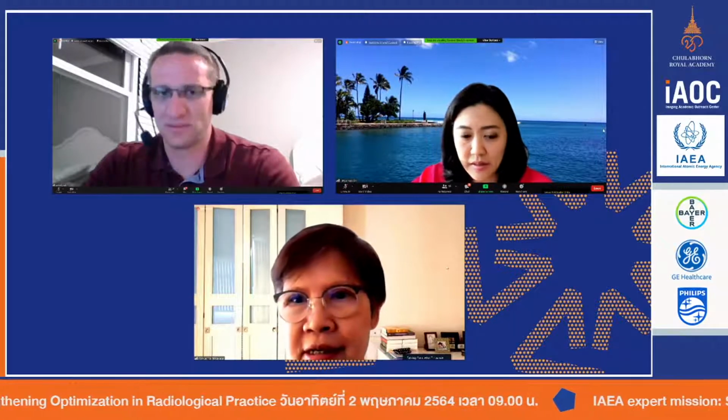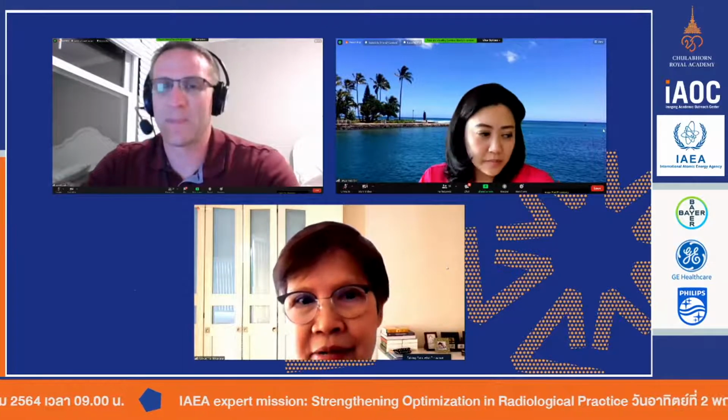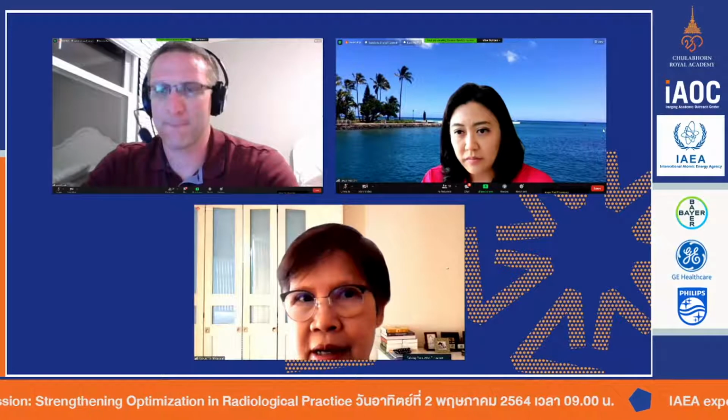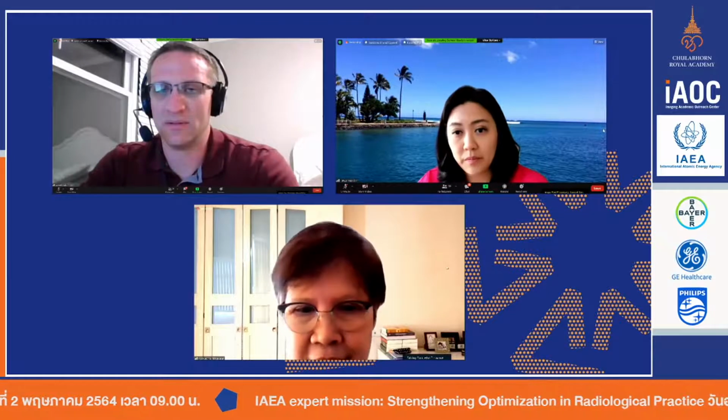You talked about the post-processing, the 5 steps, and I think the 5 steps occur before archiving, right? Before sending to the archiving system. And how about the electronic clipping done by the technologists, at what step does it occur? You said that collimation affects the histogram. Is the collimation automatic, or does the technician do it at the beginning?